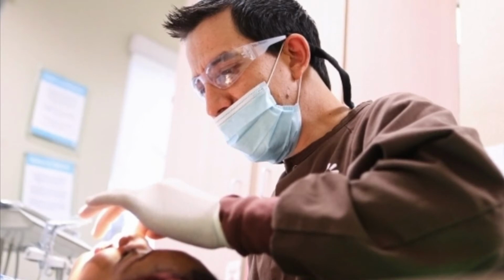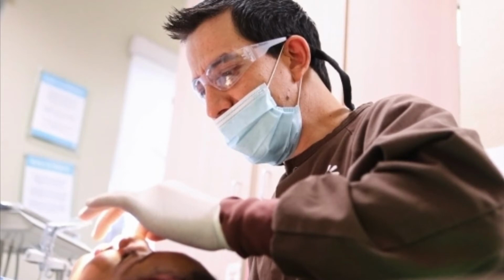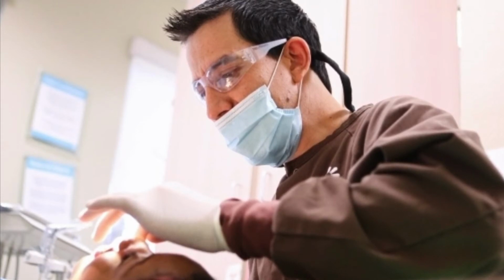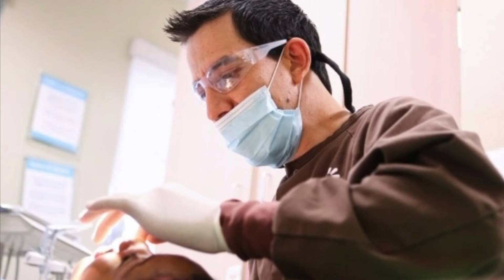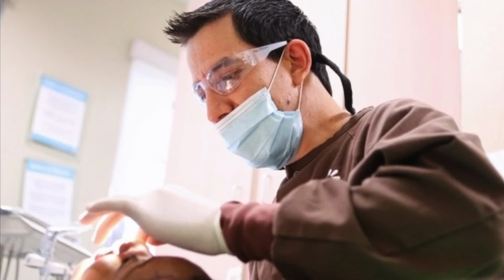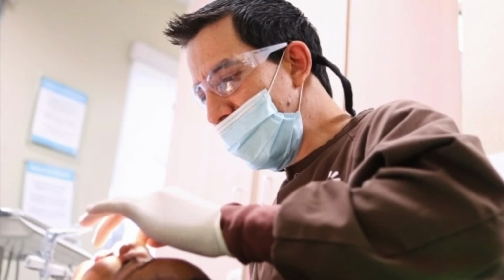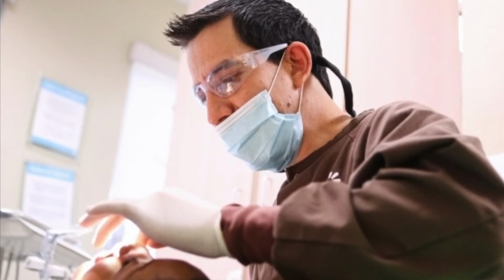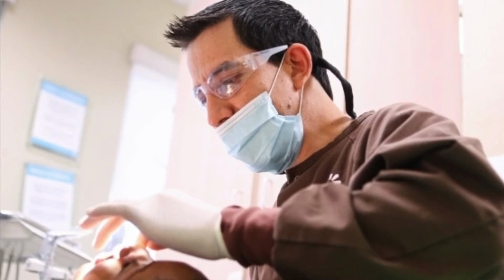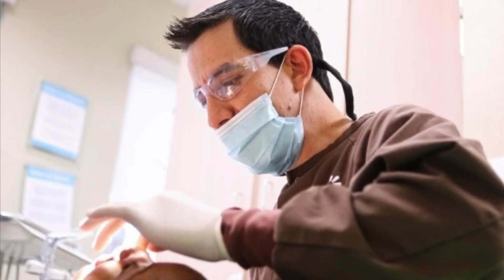Reference points: what is the reference point? It is very easy to answer this question. The reference point is the site on the incisal edge or occlusal surface from which measurements are made. Usually it is the highest point on the incisal edge in anterior teeth, and the tip of the cusp in posterior teeth. It should be stable, easily visualized during preparation, and will not change during or between appointments.